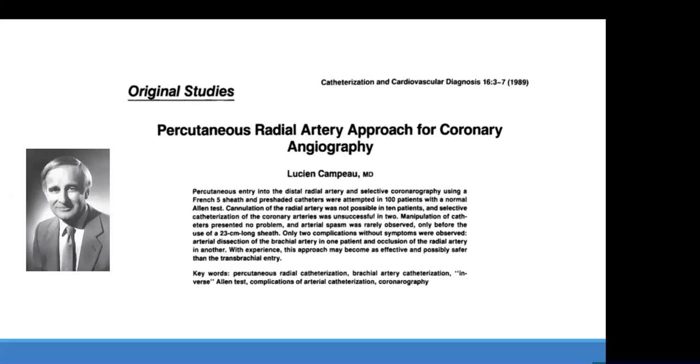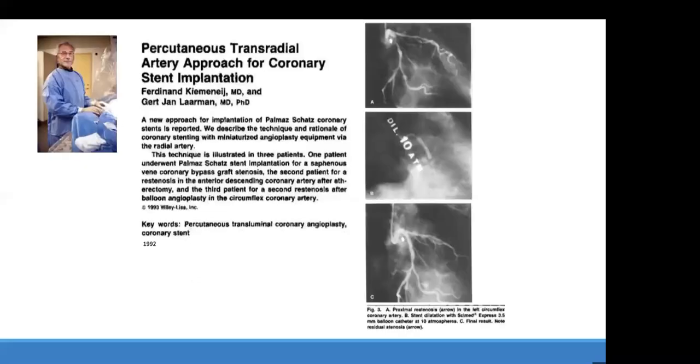In the beginning, coronary angiography was done by radial and brachial, and then because of equipment mainly, because the technology wasn't advanced in the 80s, they went back to femoral. Then somewhere in the 90s, radial became popular, got back on track, and became the default nowadays. So I recommend that anyone read this. This was the study he published confirming that it's easy and you can do it safely for patients.